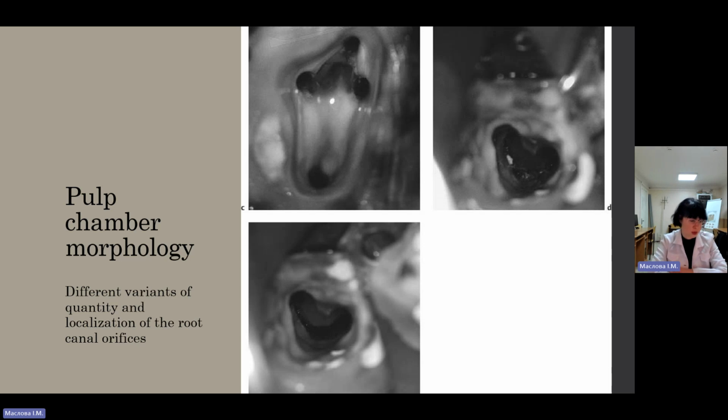It is necessary if you want to get the access in the molars, upper molars, and upper first premolar. Examination of the tooth will provide guidance to the position, size, and angulation of the access cavity, as the tooth is tilted in one or more planes relative to the arch and adjacent teeth.